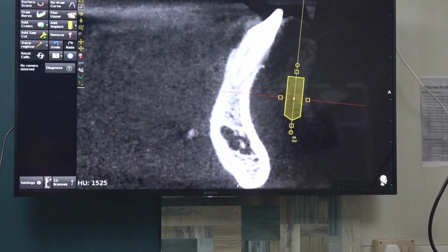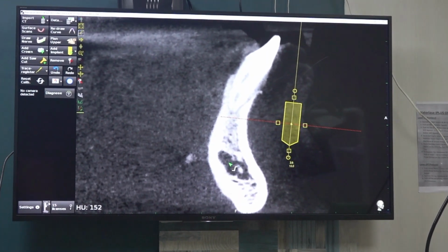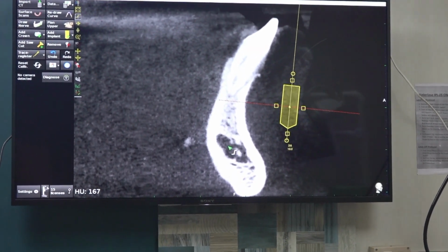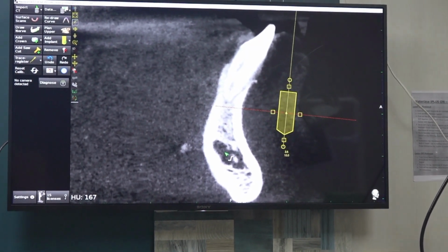You will see bone loss surrounding the apex of the implant, because if you induce bleeding here, there is no way the bleeding is going to go away. The pressure increases there.